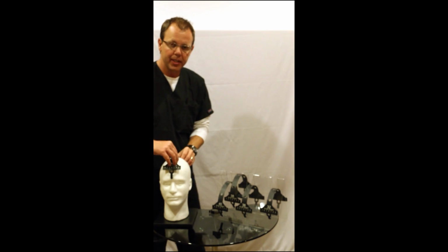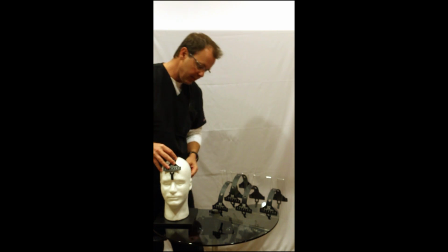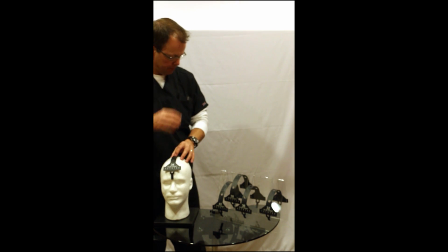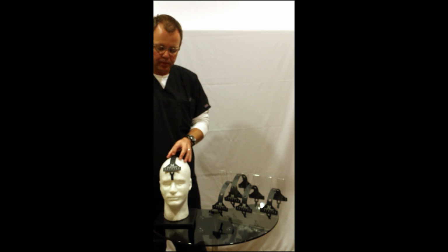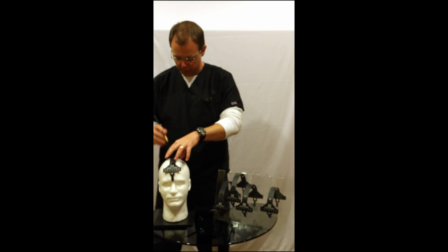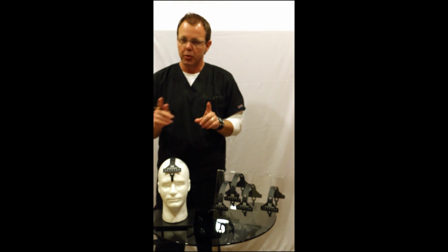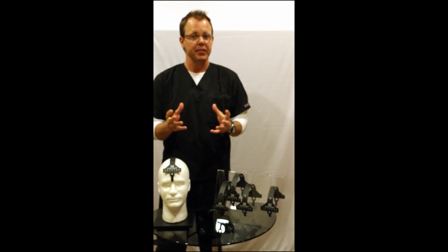So I'm going to take that and put it into Z line position first. Once I line it up with my nasion and my inion, I'm going to take my tool and mark my 10%, 20%, 20%, 20%, 20%. And then if you remember, my circumference was 54 centimeters.